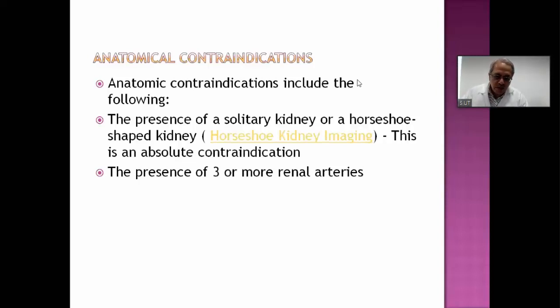There is always a disparity of anatomy from where you have taken the kidney and at which point you are actually transplanting it in the recipient. By disparity of anatomy, I mean that there might be a smaller length vessel that you have dissected, and there is a very deep right or left iliac fossa in which you want to place the kidney.